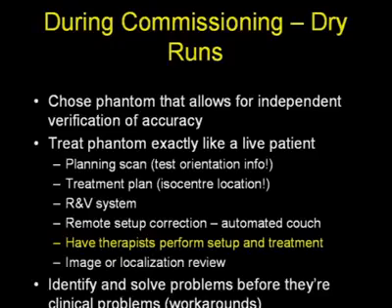One would also be well advised to test at this time the remote couch setup, make sure that it works accurately. And it's also at this time that you should have therapists get involved and perform the setup and treatment of the phantom so that they're part of the dry run test from the get-go, and they get to learn, again in a multidisciplinary environment with the guidance of physics, how to optimize a clinical process.